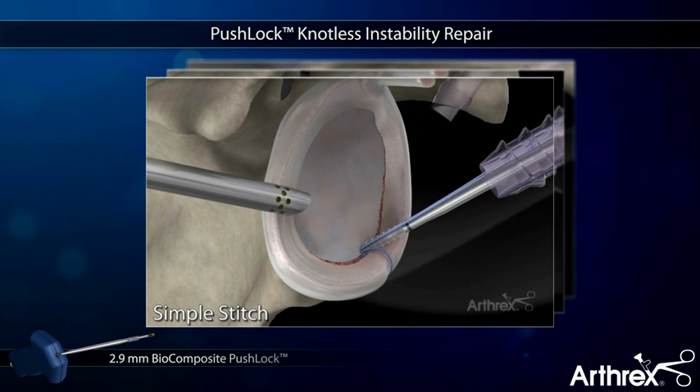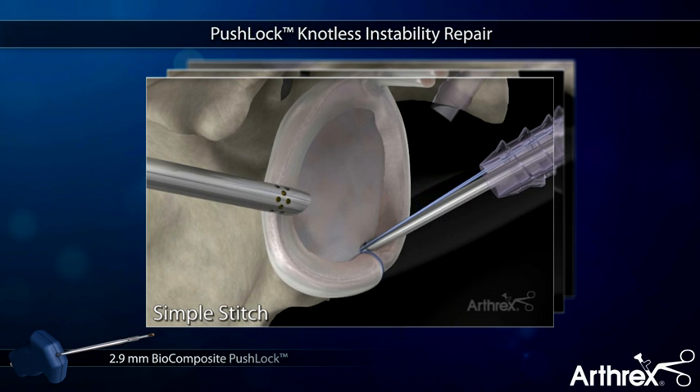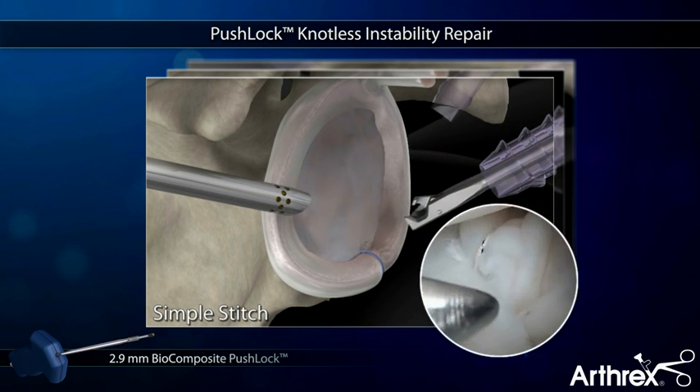The fiber wires are delivered into the bone socket. Tension is clearly visualized, adjusted, and then locked into position with the PushLock anchor body, creating a strong and low-profile construct without knots.